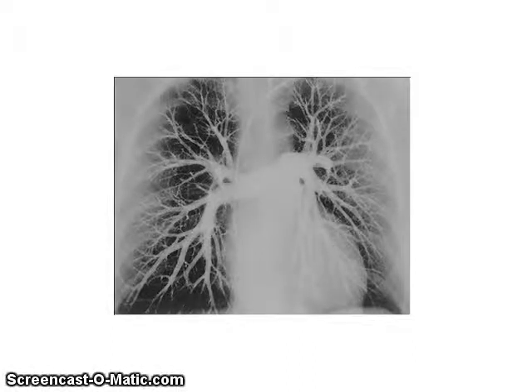The first one is the pulmonary arteriogram, which is an arteriogram of the pulmonary arteries. What you need to remember is that the pulmonary arteries are deoxygenated, and you have to access the pulmonary arteries through a vein. It looks like in this picture they have accessed it through a subclavian or possibly a jugular vein. So it's going down into the superior vena cava, into the right atrium, right ventricle, and then up through the pulmonary valve, and the catheter is now sitting right about here in the pulmonary trunk or pulmonary artery. They inject the contrast, and then contrast goes out to the right and left pulmonary arteries.